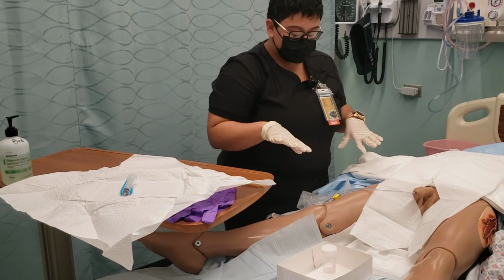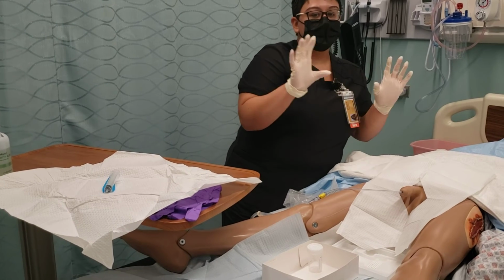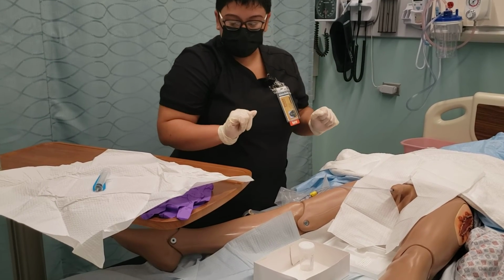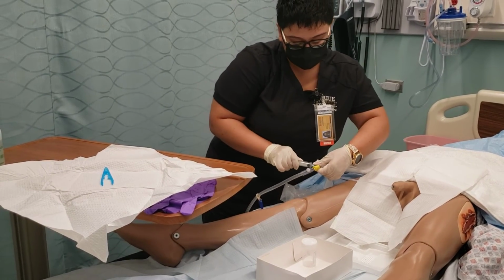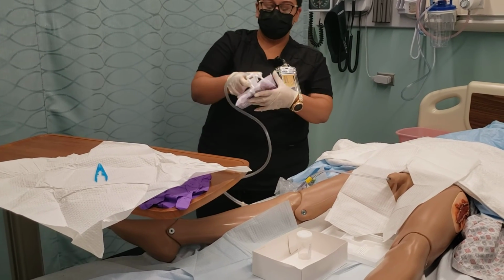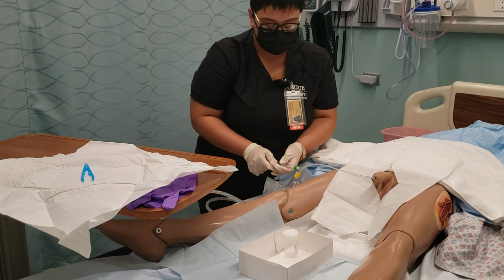It's been a couple days later. Now I'm going to remove the catheter. So I already obtained the order, checked his medical record, I've checked and identified my patient, made sure he's comfortable and in no pain. I've raised the bed to comfortable working height, closed the curtains, I have adequate lighting, and set up everything. Now I'm just going to remove the Foley. Actually, I'm going to do this first. And I would remove any urine that's in the bag and measure it. Then I would attach my syringe and deflate the Foley balloon.